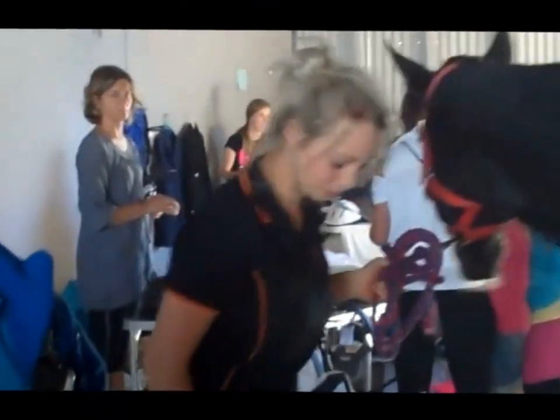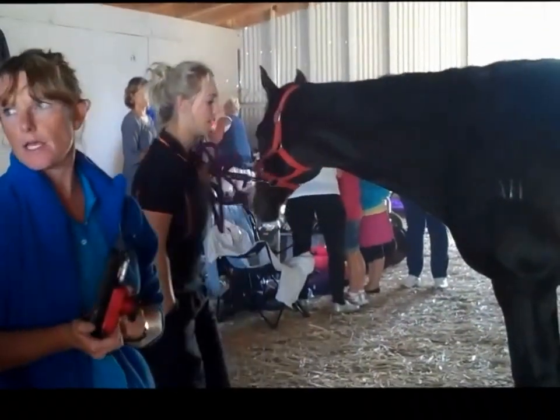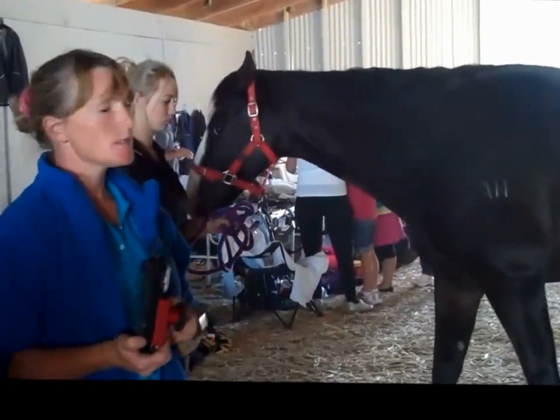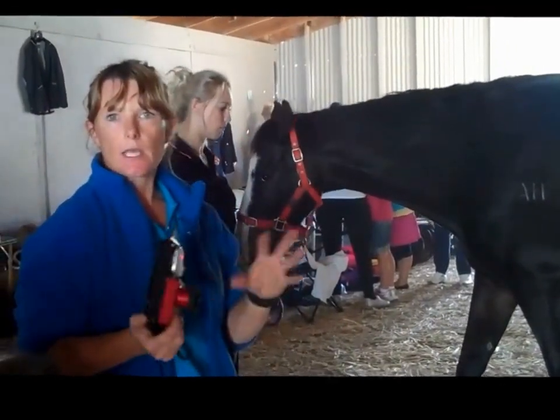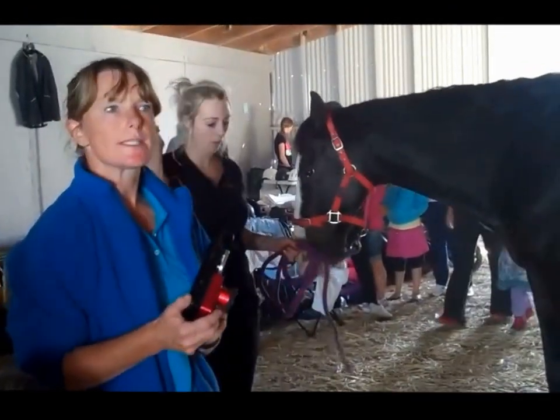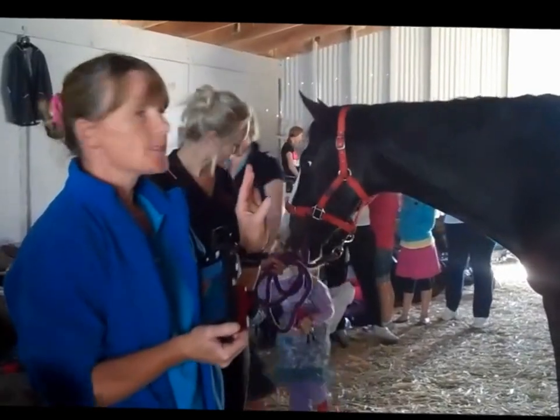When I'm doing a thermal imaging session for a horse, I'll get the rider or the owner to write a full case history down so I've got all the notes. I can then go through the notes and compare and see whether that relates to what the horse has done. Then we can actually look at him through the camera and see what's happening.